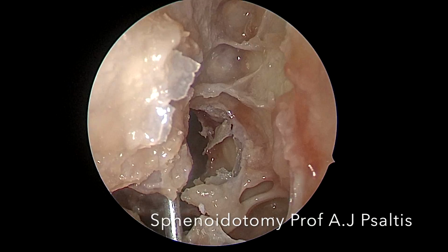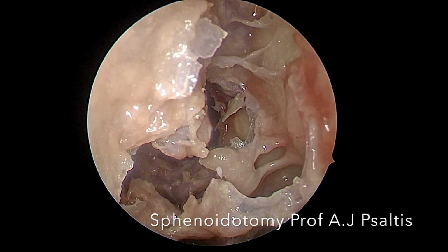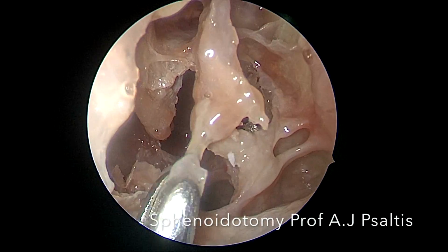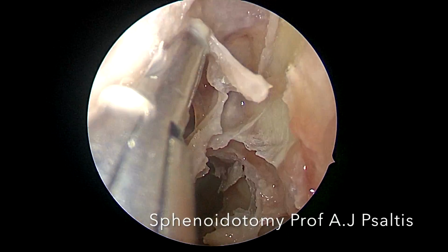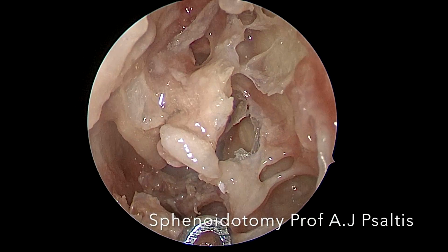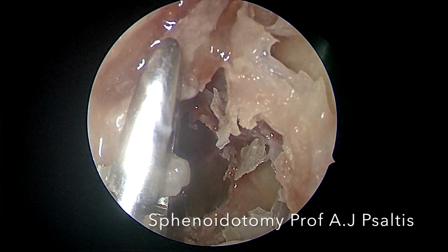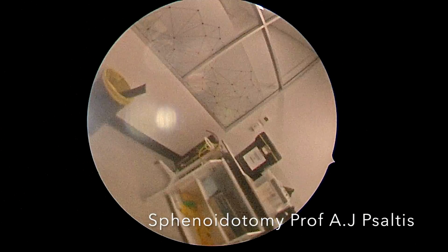Here you can see that we are using a double-ended ball probe to gently fracture the basal lamella of the middle turbinate anteriorly. A sharp instrument can then be used to resect this thin partition. Here we can visualize a cell which could harbor disease in a patient with chronic rhinosinusitis. We are now opening the cell completely and visualizing the superior turbinate medially and the skull base superiorly.